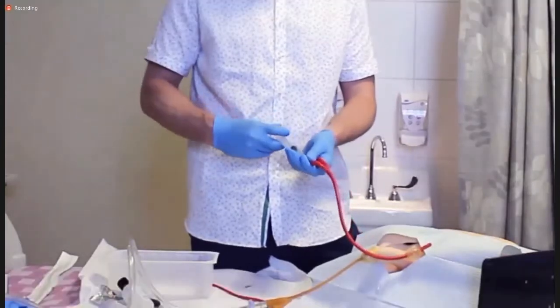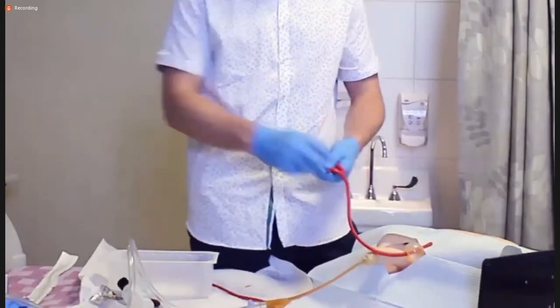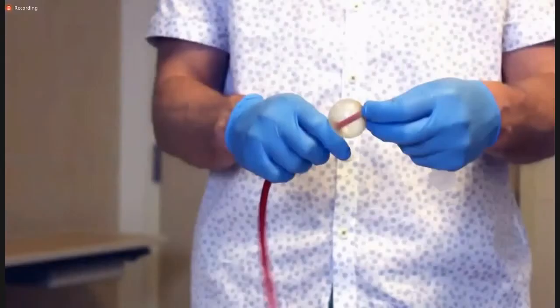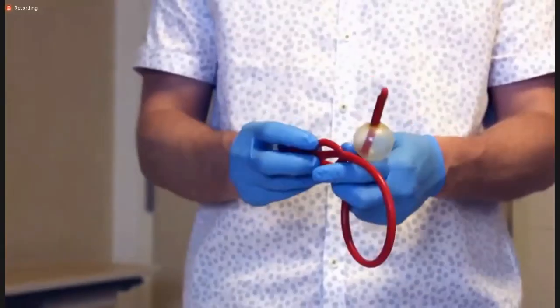It's normal size, and in this case, a three-way Foley catheter holds about 30 cc's in the balloon, as I'm demonstrating here. So that balloon, when a poor old fella steps on it and pulls it out, it can cause a little bit of urethral trauma. So in these instances, there's a lot of blood through the urethra.